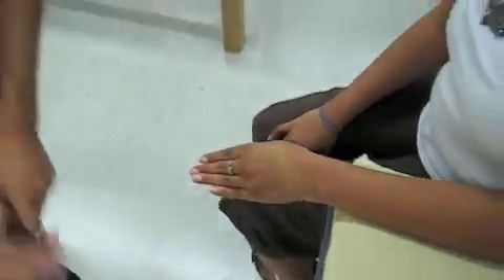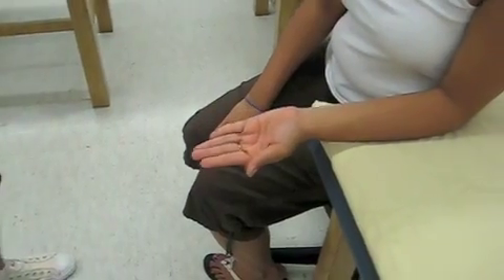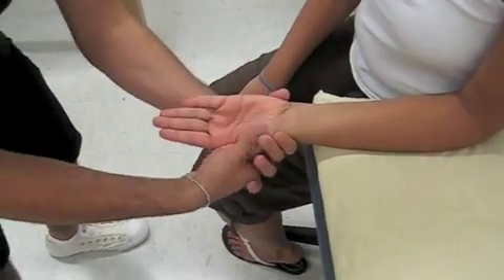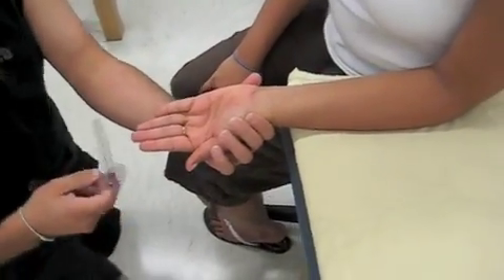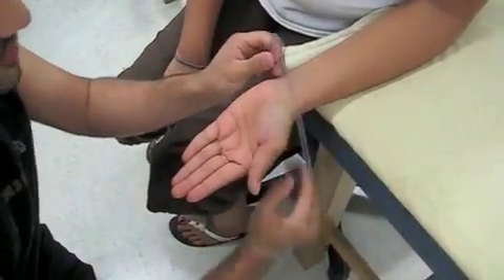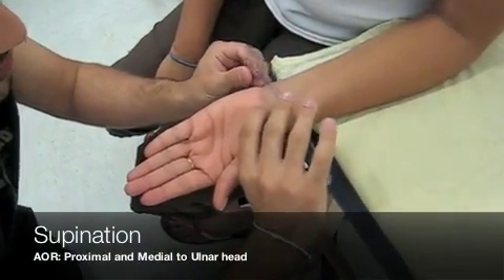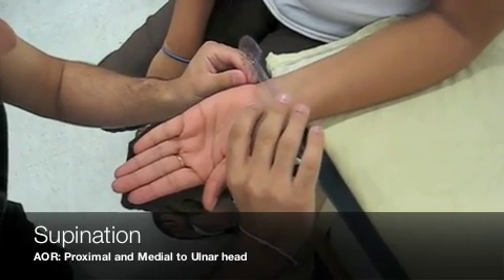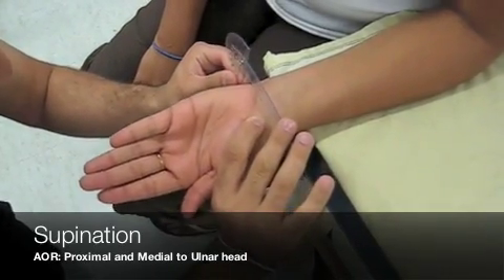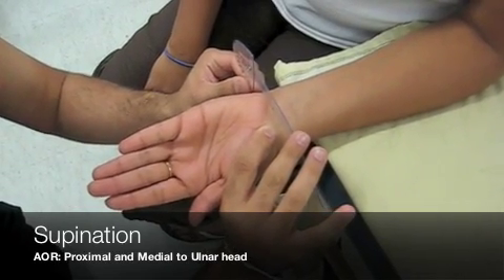Now I'm going to do supination. I ask Deepo to move her hand, then bring it back. I'm going to move it for her and give it a little bit of end pressure. I take my goniometer — same thing with the stationary arm: it's going to be perpendicular to the floor, and the moving arm is going to be on the volar surface of the wrist. I get 75 degrees of supination.